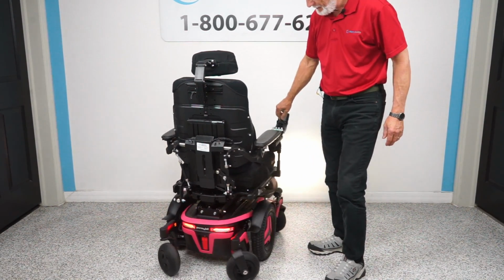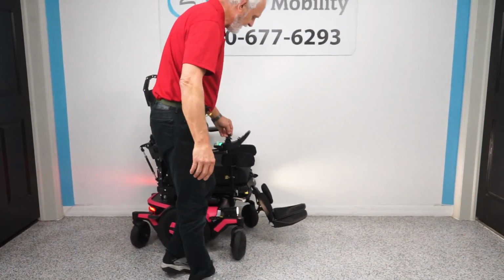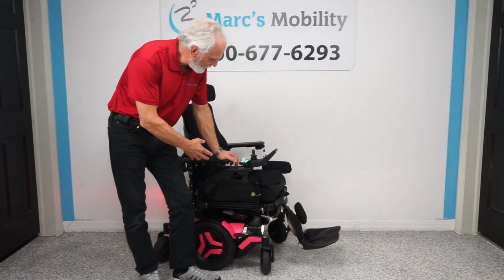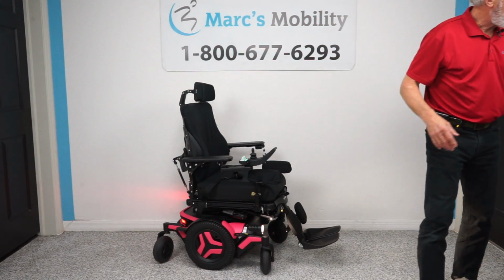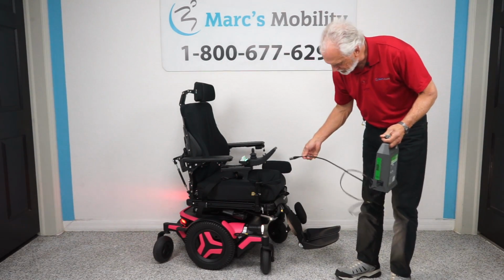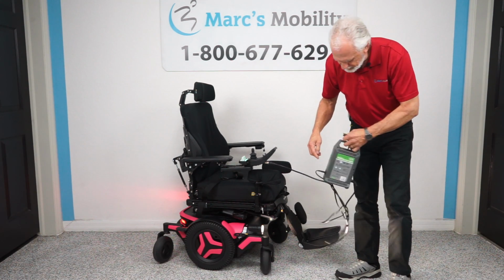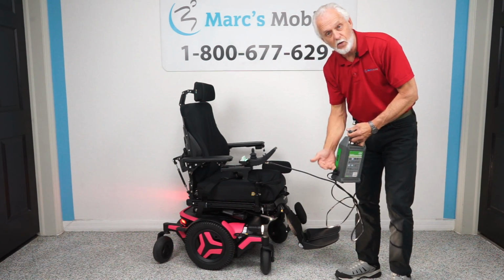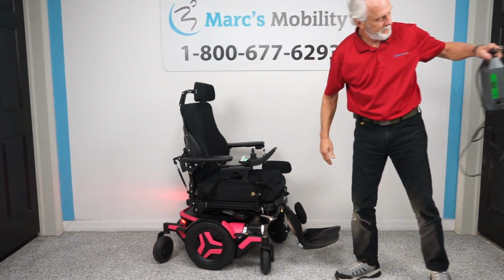Okay? So folks, Permobil chair, as I said, the seat size doesn't really matter. We can adjust it to you before you order the chair. When you charge the battery, you'll take your Permobil charger. This is one example of a Permobil charger. You plug it right here, and as soon as the light goes to full or 100% or green, the charger will shut off when the batteries are full.